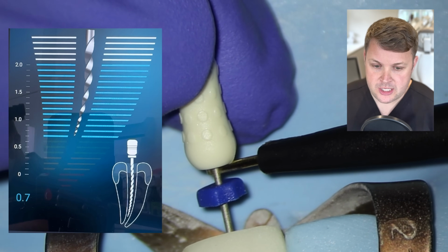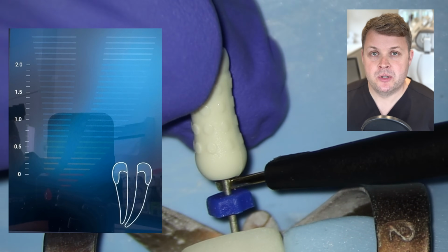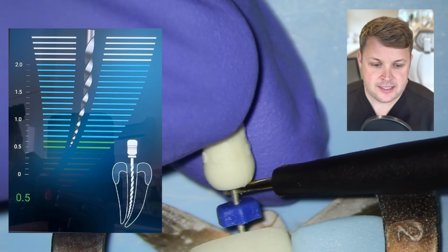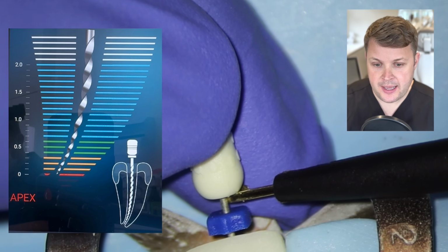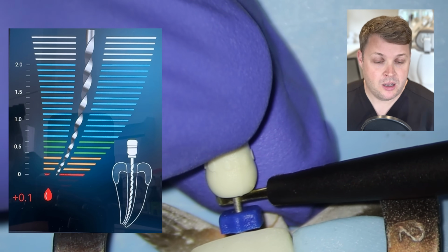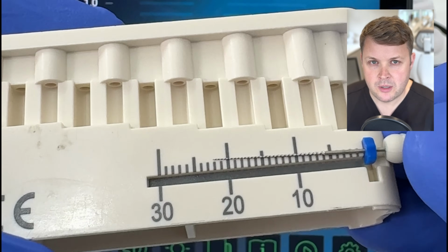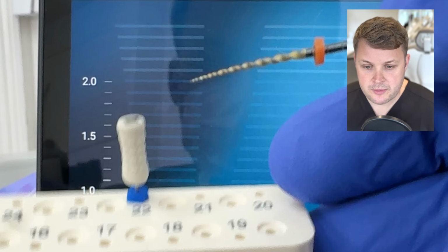As I push this size 15 K file to length, the corresponding measurement on the apex locator is moving at a relatively similar rate. With the apex locator, we push it out the apex so we get an over reading, and then we push it back, and that's our zero reading. The zero reading here is 22 millimeters. We've accessed the tooth, it looks really nice, and now we're ready to do some shaping.